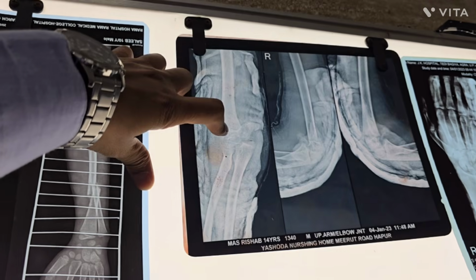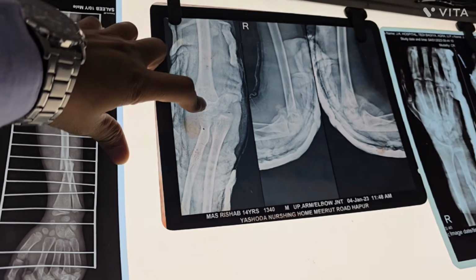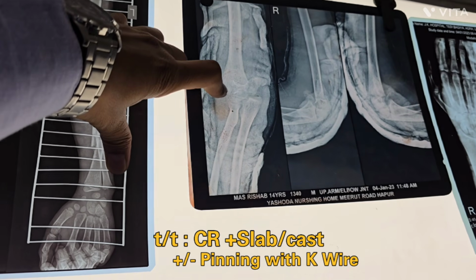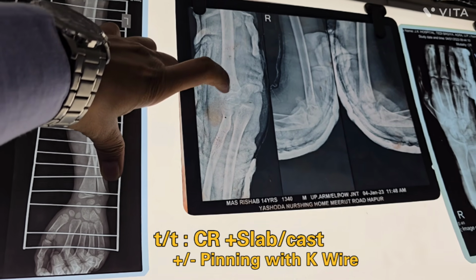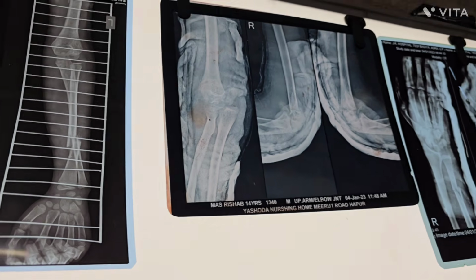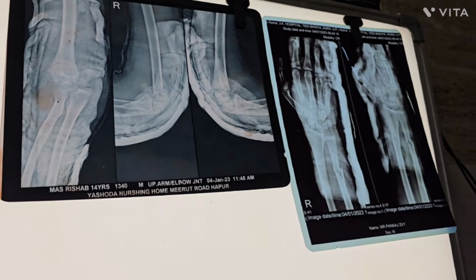So what are you going to do in this case? In this case you can do closed reduction and cast application. If it is not reduced, then closed reduction and internal fixation with K-wire, or after the slab. Okay. So the next patient.